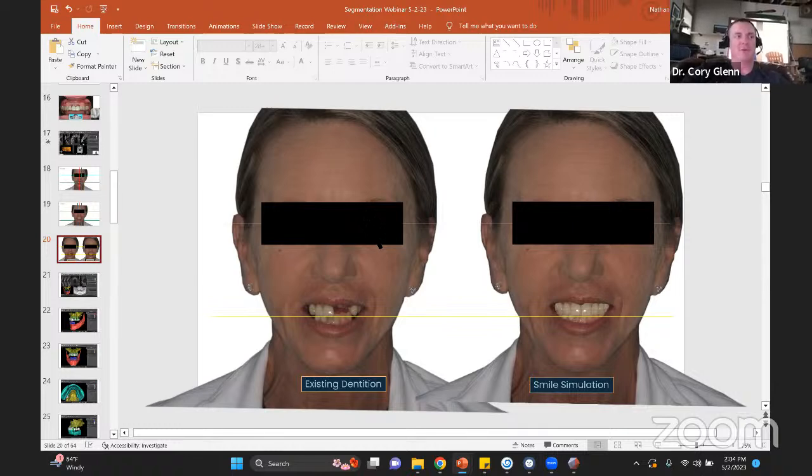So I was requesting a couple of the companies, hey, just give us like a free scan mode where whatever it captures, it keeps, and you don't end up rendering it away. But I don't know if that's been done. So something you might experiment with the various intraoral scanners.